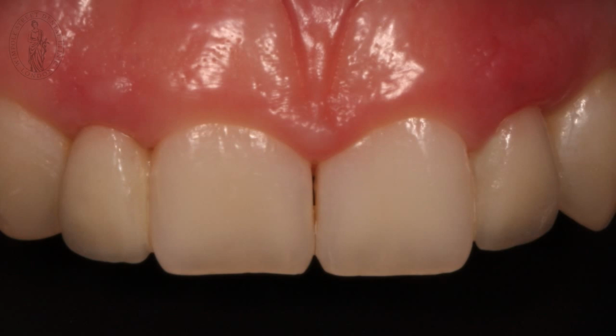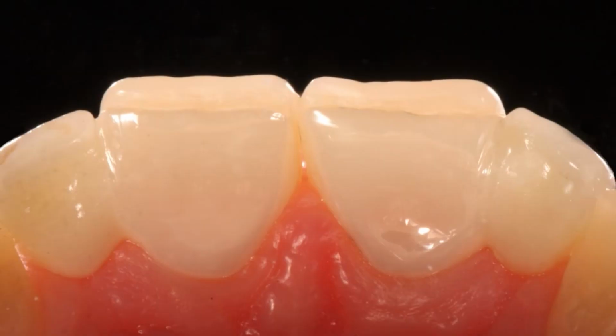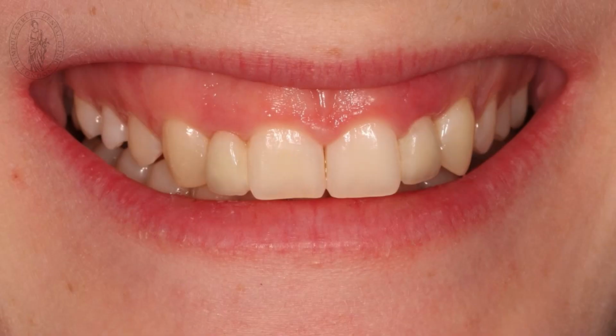And then the bridge is in place. This is directly after placement. This picture has been taken, so there's a slight color difference. In a couple of hours it will be exactly the same color. And then the bridge from behind, from the palatal side, and you can see absolutely perfect fit, and the small ridge you have on top of the teeth is normally no problem for the patient to accept. And you can see the final picture. Color, like I said, will adjust. The gums on the right side will adjust a little bit as well, but it takes a couple of weeks.